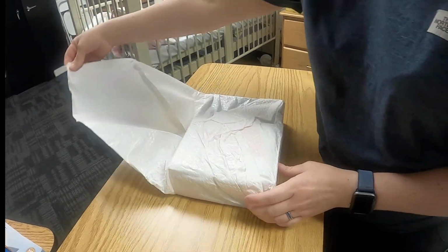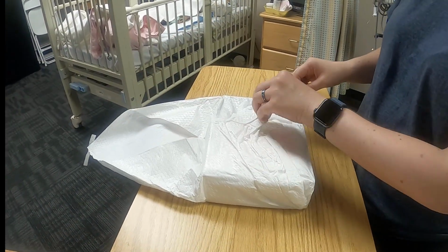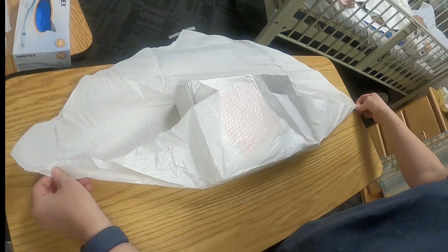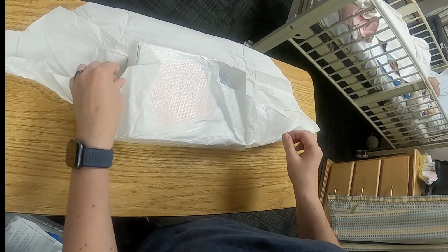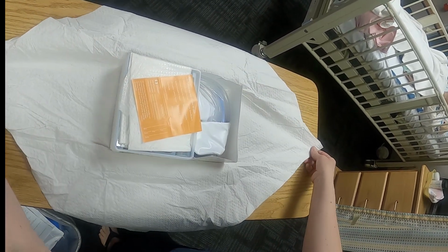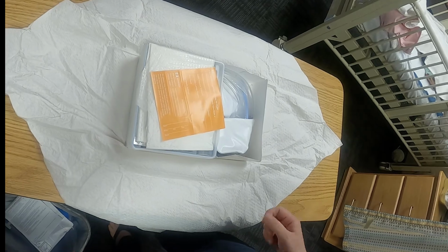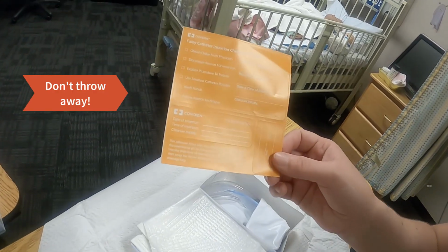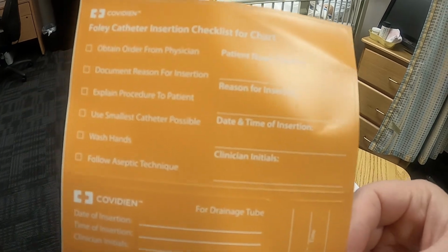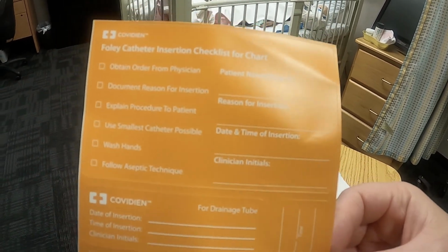So we'll go away from ourselves. Okay, fanning it out, and then coming towards us. There we go. So the stuff that is on top. Okay, so this here is what we attach to the Foley then afterwards.